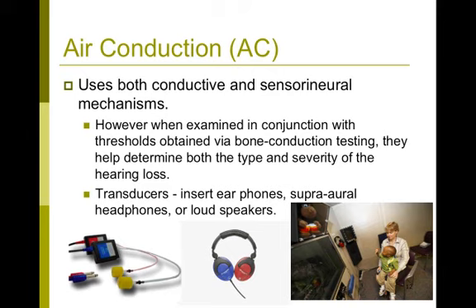Air conduction is typically tested with transducers such as supra-aural headphones, typically earphones, or insert earphones, like over here, or you can present air conduction sounds through loudspeakers, like in this instance, where the sounds are actually presented through loudspeakers. And that might be suitable for some populations, especially pediatrics, who do not tolerate wearing headphones or insert earphones.